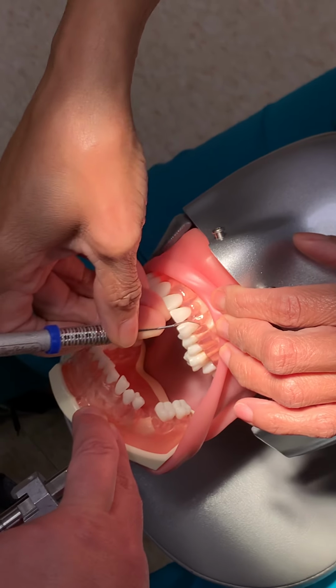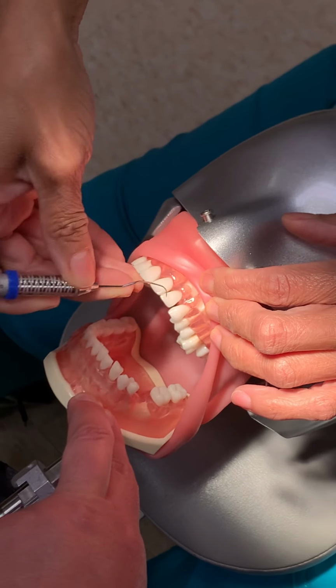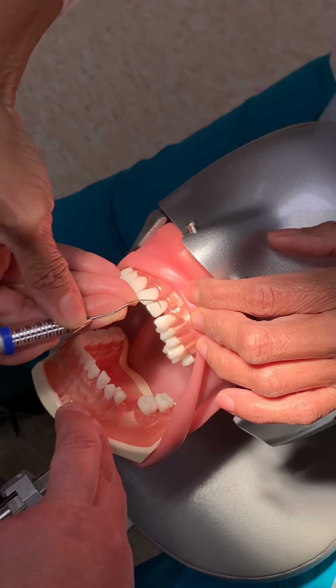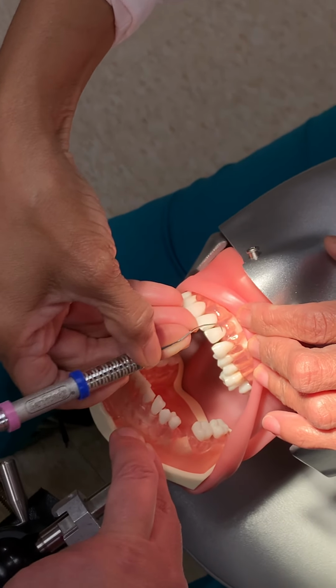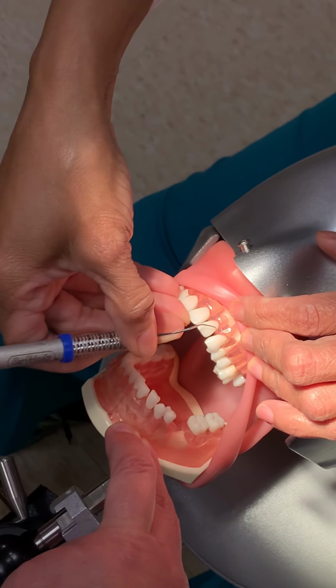And I always want to start in the get ready zone, because if you go in and just go straight to the mouth, you can slip. So you establish your tip third here, establish your fulcrum, look at everything together, and then slither into the get ready zone. And slither into the gum line.